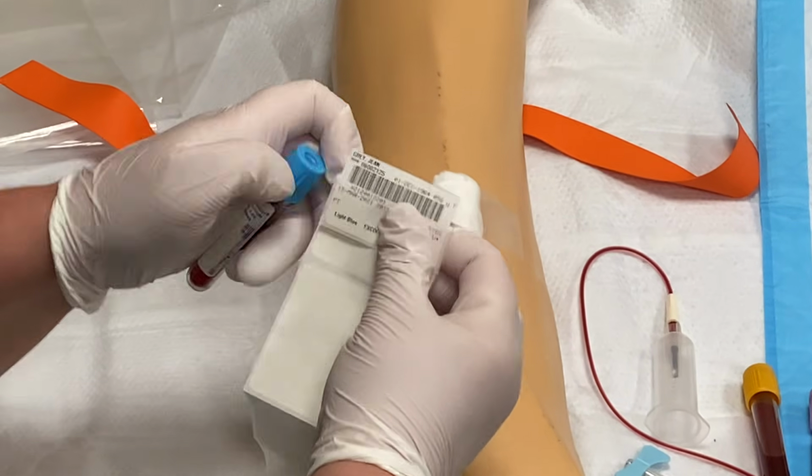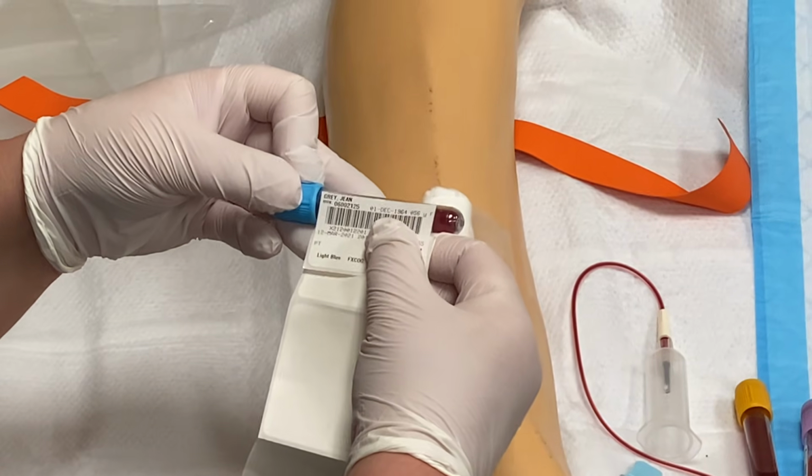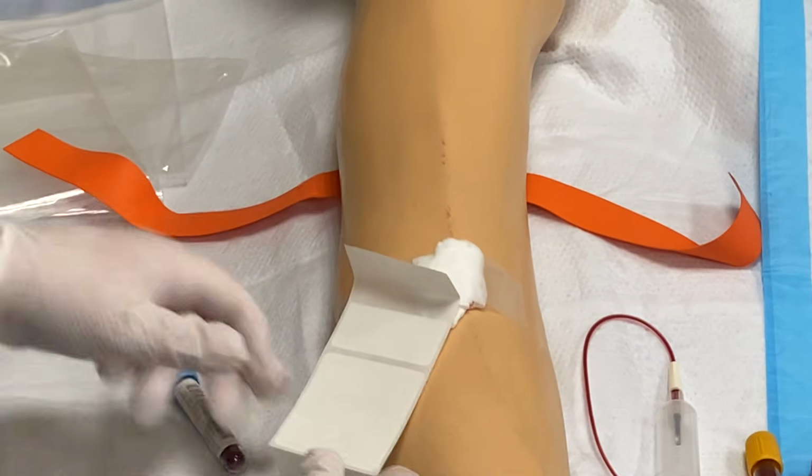I like to bend my labels back. The patient's name always goes towards the colored top of the tube, and I'm gonna cover the manufacturer's label. So I can spin that around, and my blue tube is labeled.